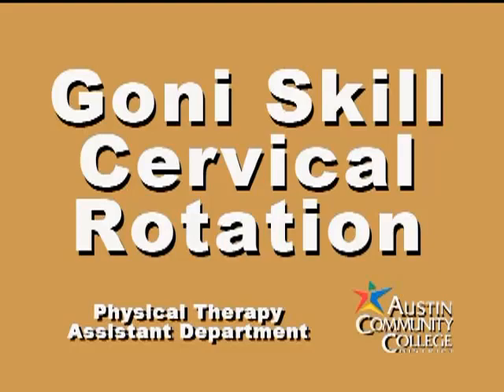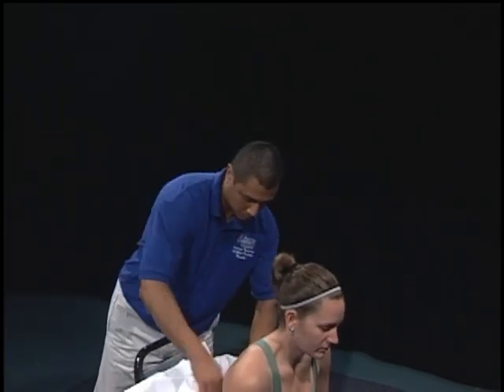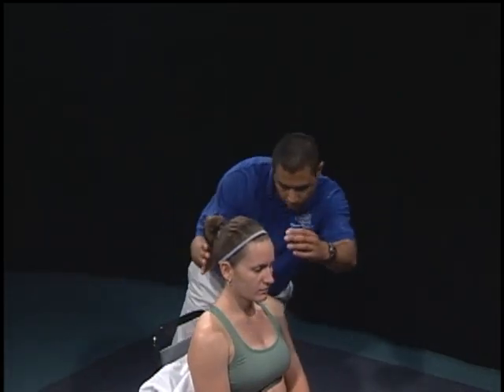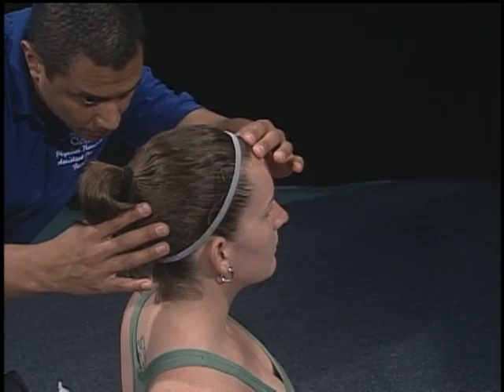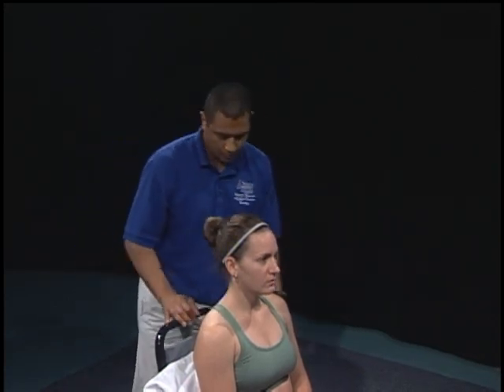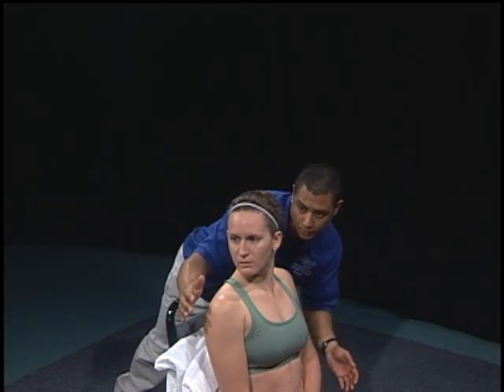Goniometry of cervical rotation. Position the patient in sitting with the thoracic and lumbar spine well supported by the back of a chair. Position the cervical spine in 0 degrees of flexion, extension, and rotation. In patient-appropriate language, ask the patient to rotate the neck. Assess the shoulder girdle for rotation of the thoracic and lumbar spine.